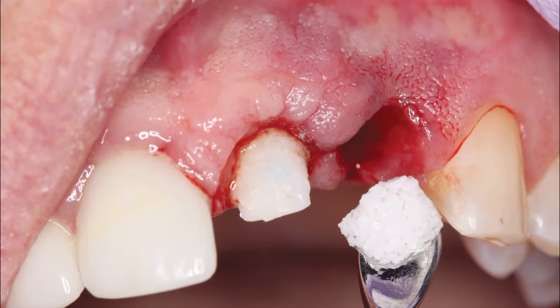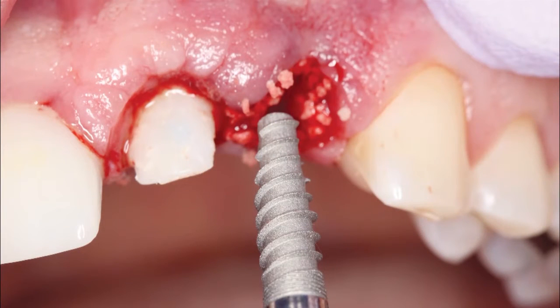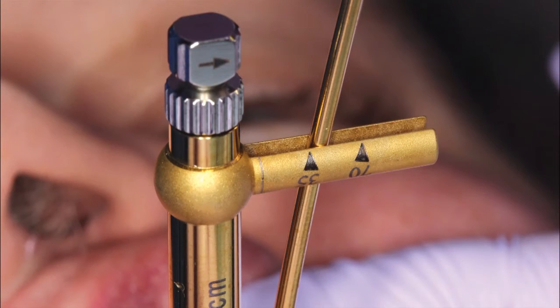The grafting material was placed at the extraction site. The Serosorb M material from CuraSan was placed in the osteotomy site prior to implant placement. The 3.5 mm by 13 mm Hahn tapered implant was threaded into the osteotomy until fully seated and exhibited significant initial stability. Maximizing primary stability is crucial in implant therapy, particularly for immediate extraction and implantation.